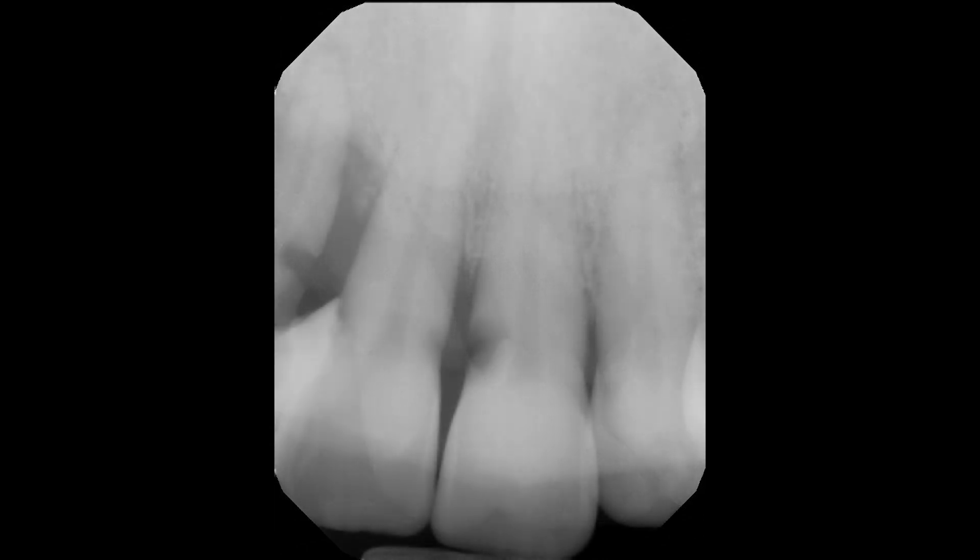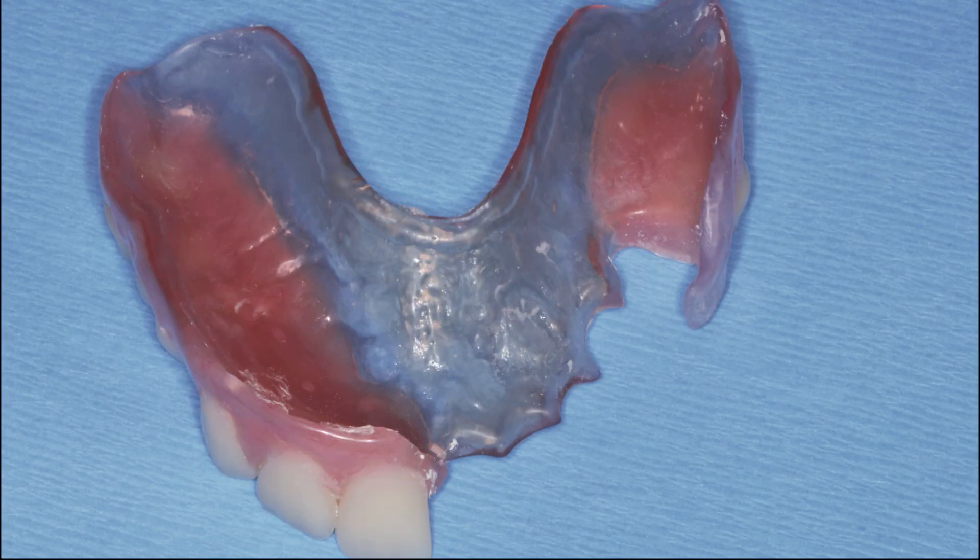The preoperative radiographs confirm that the mobile teeth indeed need to be removed — they are non-treatable. The laboratory fabricated a removable appliance, which will be seated following extraction and implant placement and is used during the entire osseointegration time period.